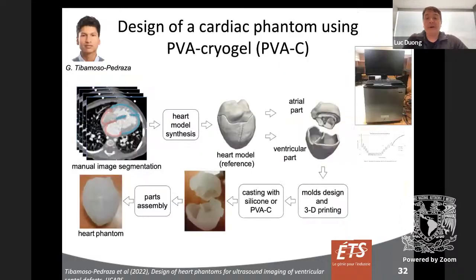So with our protocol, we decided to generate phantoms, including the VSD, to be able to better study how we can do the puncture and also to be able to train cardiologists. So we decided to do 3D printing again. And with 3D printing, we found out that it's very useful for congenital heart disease since the anatomical structure is very complicated, very different than a regular adult patient. So it's very valuable to have a physical 3D representation in hand of the complex anatomy of the patient and to be able to play with it, study it, understand it, and then go to surgery.